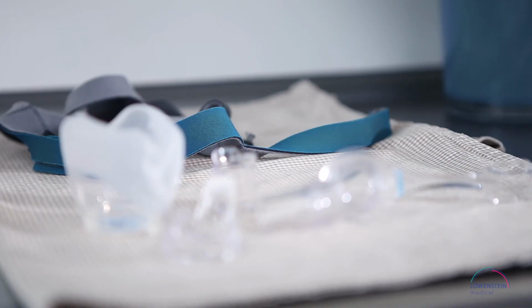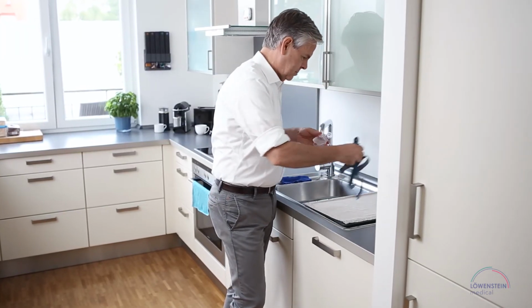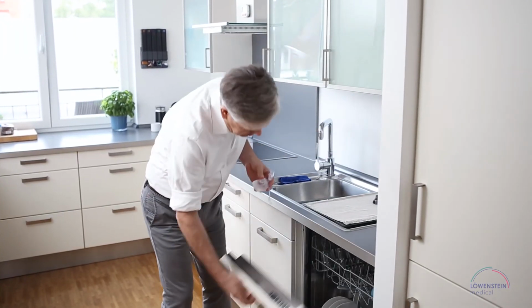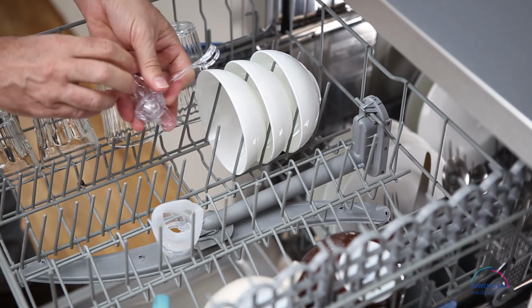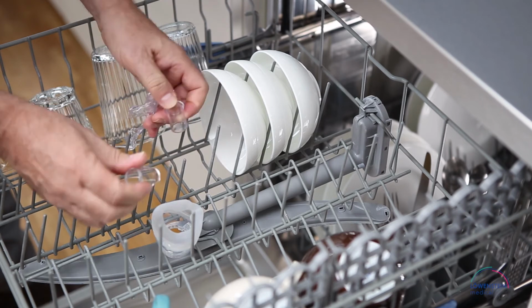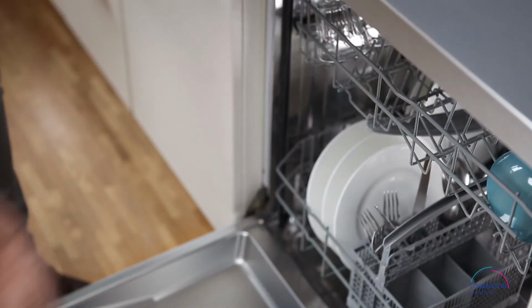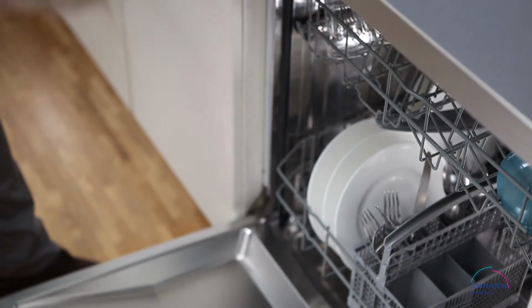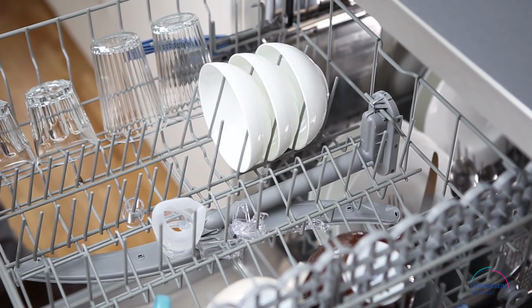During the day, allow all parts to air dry in a place protected from direct sunshine. We also recommend that you clean all mask parts, except for the headgear, once a week in the dishwasher. Place the disassembled mask in the upper rack with other tableware. You may use any cleaning program. This type of cleaning very effectively removes grease, sweat, or skin creams from the mask materials.